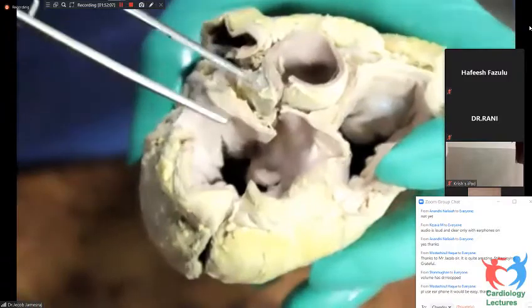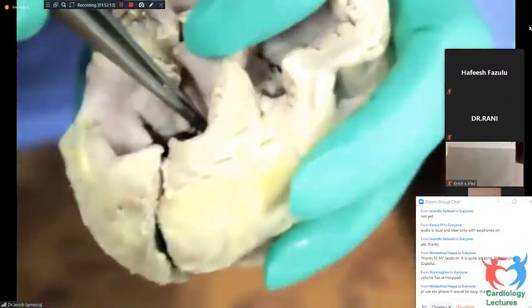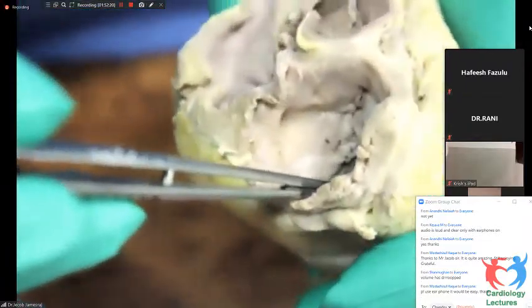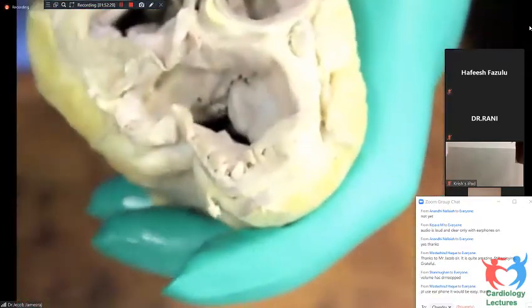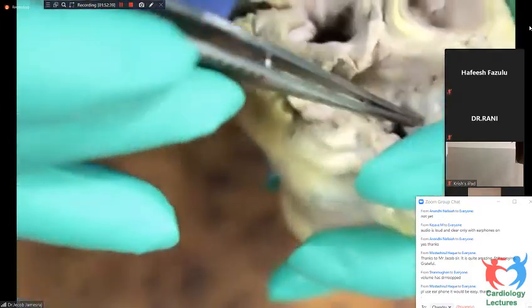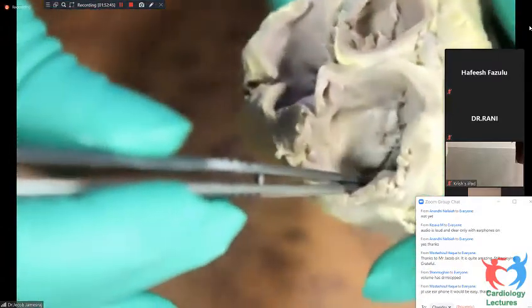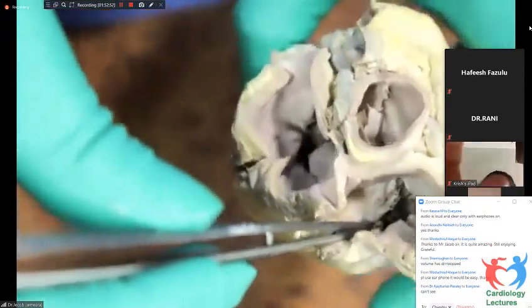Nodal cells are small, oval, and pale staining and poorly striated compared with the general myocardial cells. They are grouped together and separated by fibrous tissue. They are thought to be the source of normal impulse formation. In infants, nodal cells predominate compared to the fibrous tissue. And after that, there are some transitional cells. They have characteristics intermediate between the packed nodal cells and individual atrial myocardial cells.